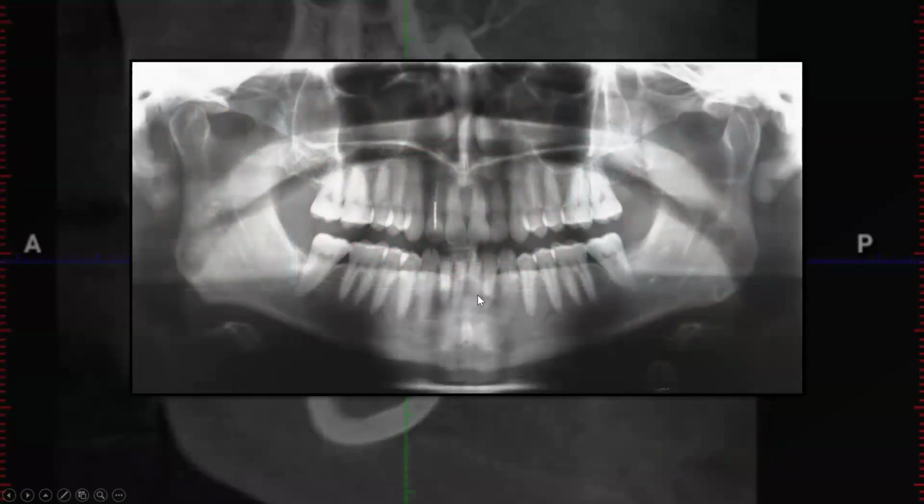Here's a case I showed you when we were going through anatomy, right? Little review here. Your pterygomaxillary fissure, posterior border of the sinus, zygomatic process of the maxilla. On the left side, your pterygomaxillary fissure, posterior border of the sinus, the zygomatic process of the maxilla, and we have this extra wall here. Is it just a sinus septation? It extends all the way up. It looks like another sinus border. It looks like an extra anatomical structure.